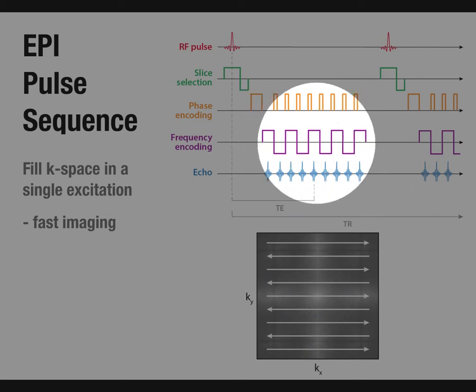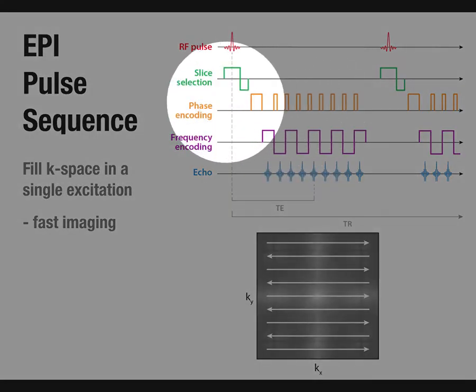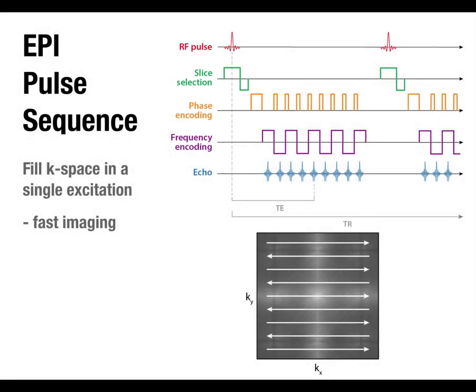So what I described last time for structural imaging, you would do the slice selection and then you do one phase encoding step. Along one dimension, say our phase encoding dimension is front to back in the head, you'd create a gradient of some steepness along that, create that phase roll, remember those sine wave gradients, right? So create that sort of stripy pattern. Then you do your frequency encoding to read out the other dimension in your slice.